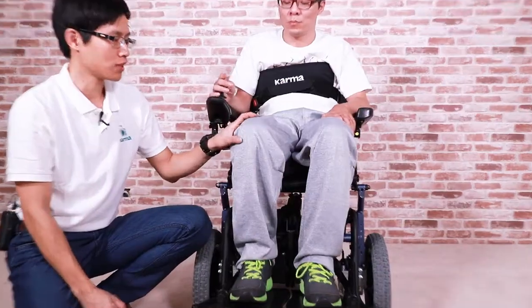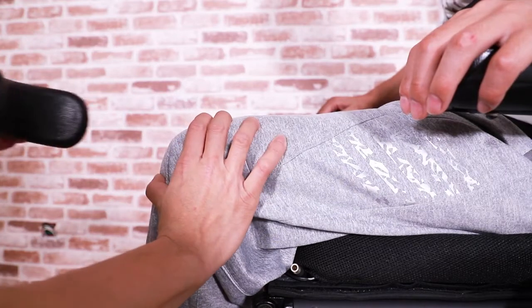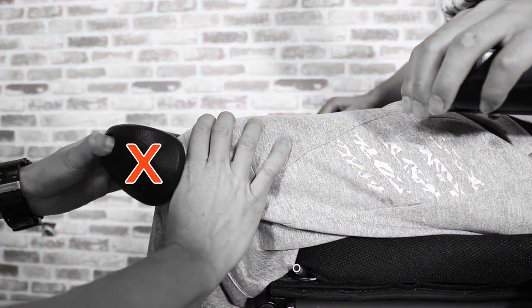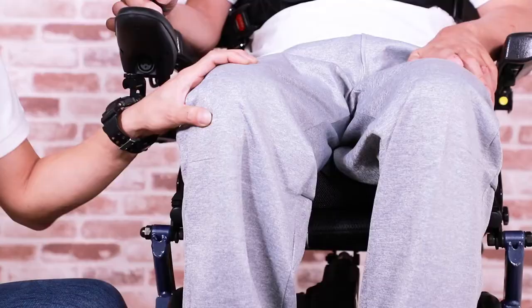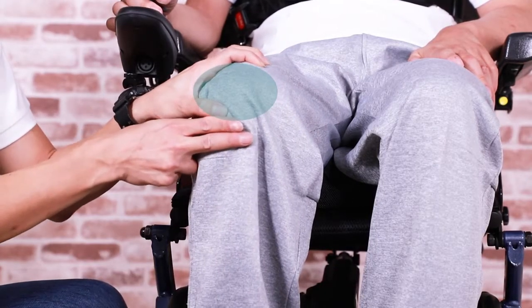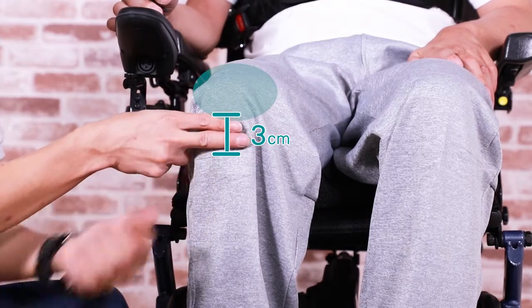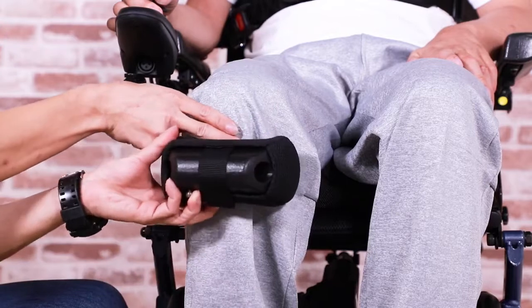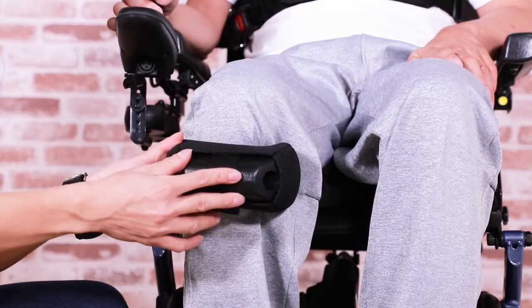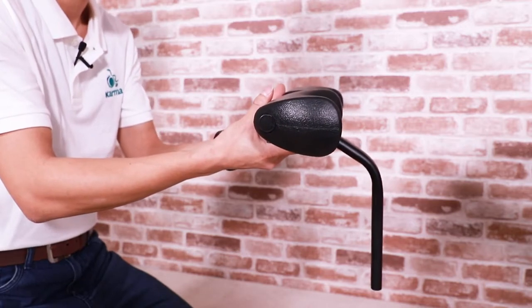How to adjust the knee support? Firstly, we need to find out where the kneecap is. We don't want the pad to be placed directly on the user's kneecap because it will create too much pressure. We hold the kneecap like this. 3 centimeters below the kneecap, which is roughly 2 fingers wide, is the position that we want to place the pads.